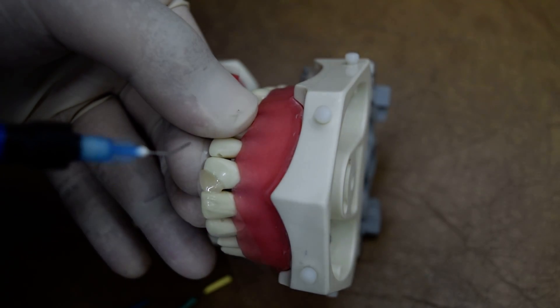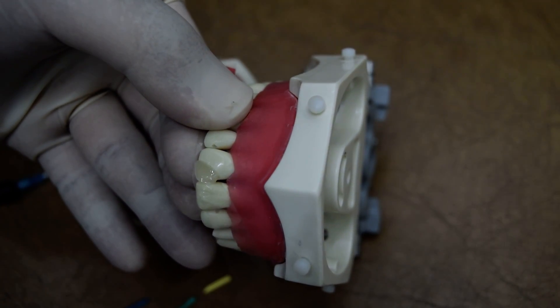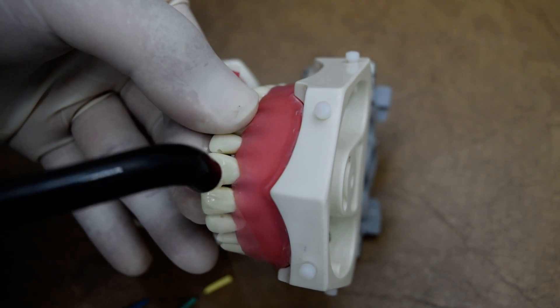So we fill it a bit in excess, then we can trim the excess during finishing stage. Then we will apply the light cure.